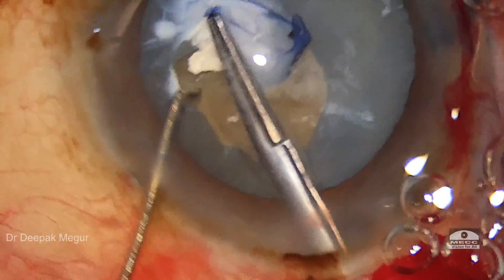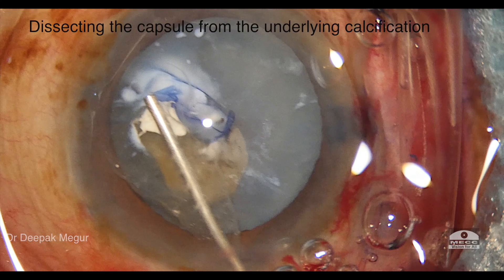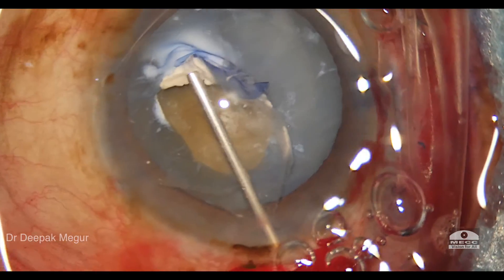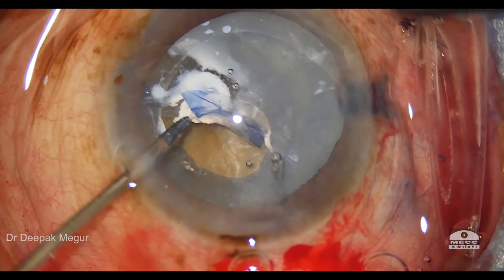The problem really is the underlying white flaky material, so we need to stop here and dissect the capsule away from the underlying calcified area. I'm using viscoelastic to try to separate and tease out this thick calcified area.